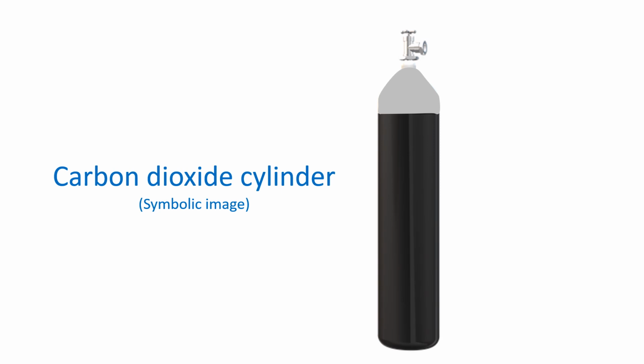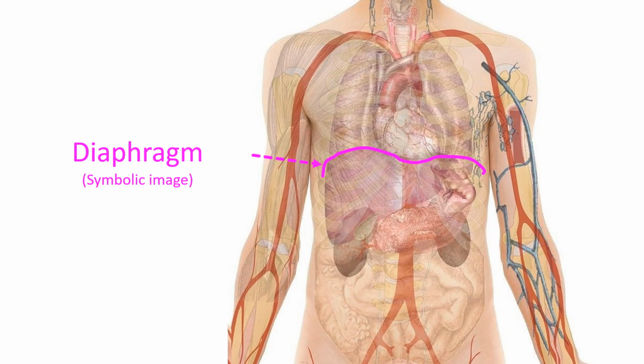But the technique of carbon dioxide angiography is a little cumbersome than usual contrast angiography. We need a medical grade carbon dioxide cylinder, three-way stopcocks, connected tubings, syringes, and a reservoir bag for interim storage of carbon dioxide. Carbon dioxide angiography is an alternative in those with contrast allergy, as carbon dioxide is non-allergenic.